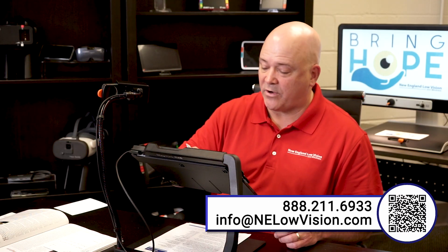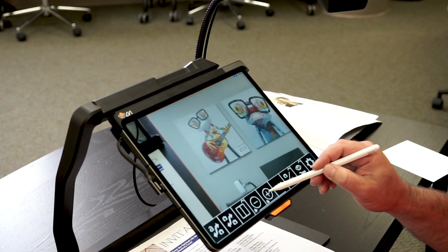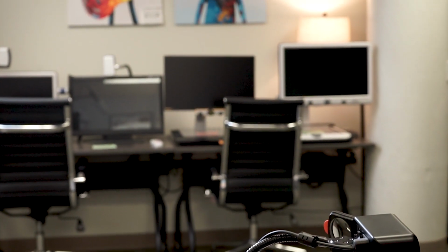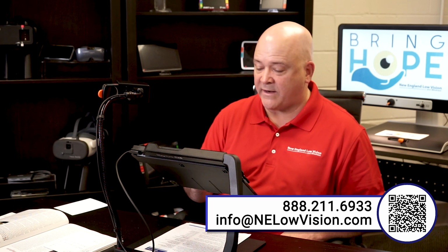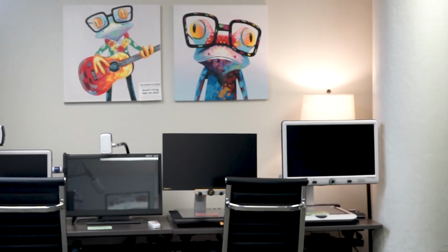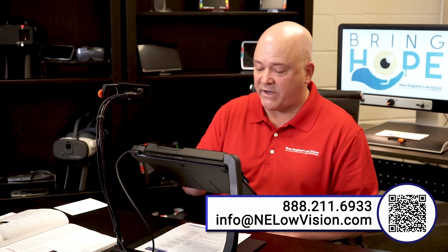So what's nice also about the camera for distance viewing is that when I zoom in on that, that's quite a distance away. That's about 12 feet away, and I don't think teachers are going to write that small. But if they did, then you can just zoom in on anything that you want to see and have it come up on screen. And then easily go back to your reading material underneath or go to a full screen.